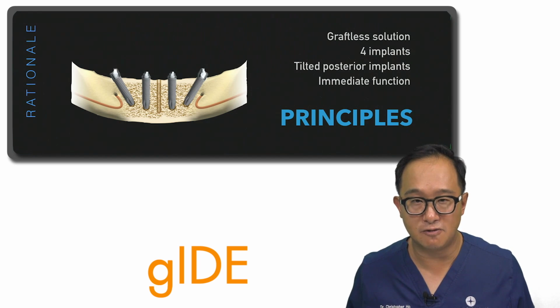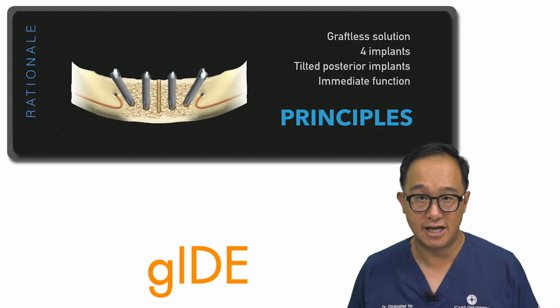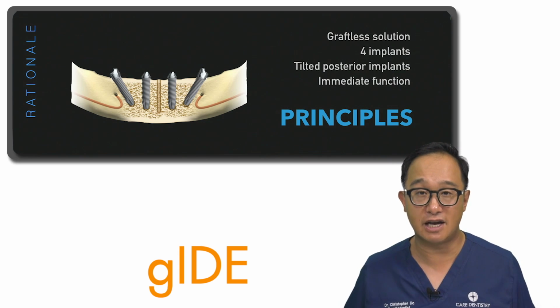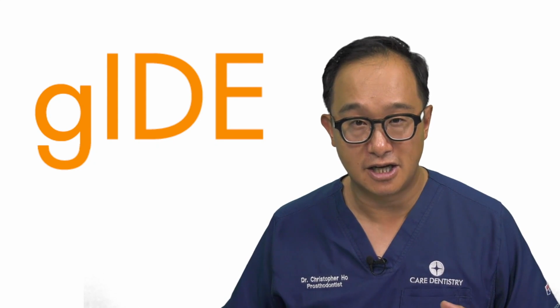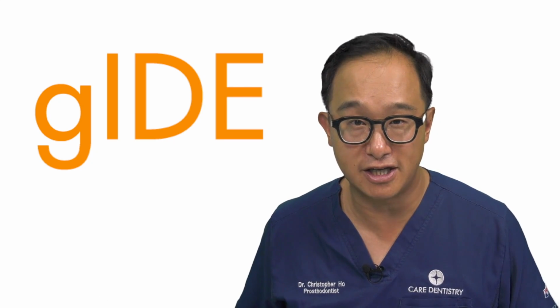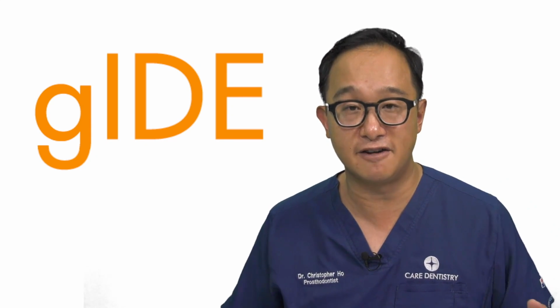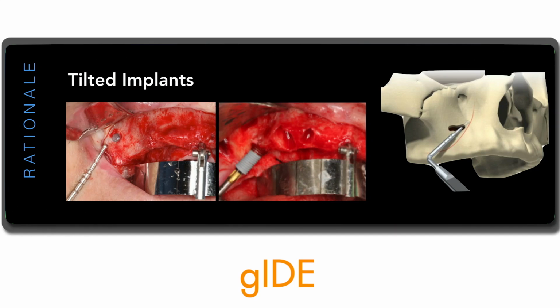And I remember Malo once talking about this. It's just like a chair that you're sitting on. The chair has the 4 legs, and the 4 legs have to be positioned correctly to support the load. And in this case, we have to place our implants in the right position so that we can support the load correctly. And that means that these implants have to be far enough apart. They have to have sufficient AP spread. So in the posterior maxilla, you need to engage the most distal part of the bone, avoiding the anterior part of the sinus. So these are angled.